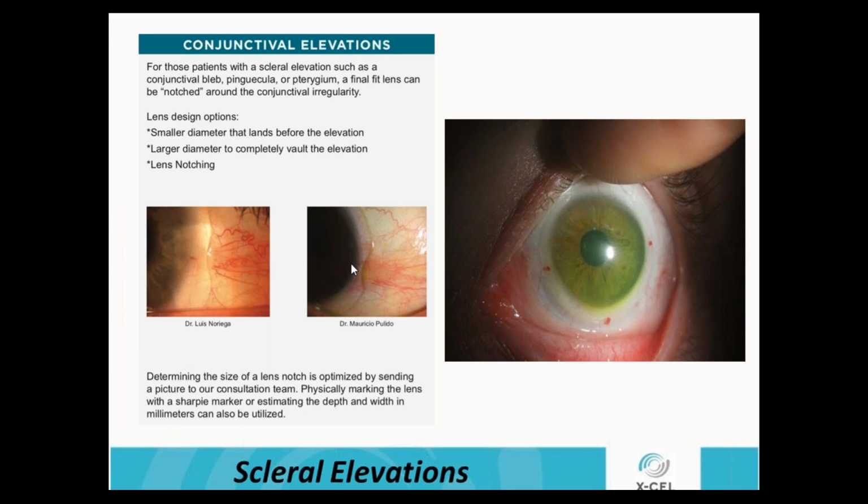You can go larger. A lot of times with smaller, we're back to a corneal lens, which we really had been trying to avoid by fitting a scleral. If we go larger, you may have to go to a 17.0, 17.5 lens, or even larger than that. Some of the problems with larger lenses is application and removal.